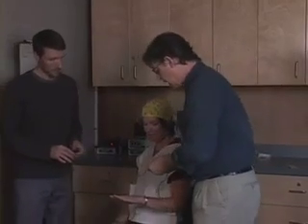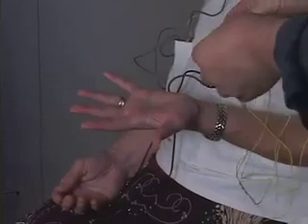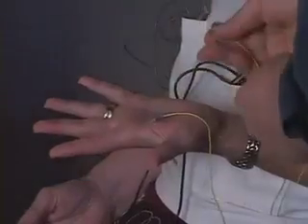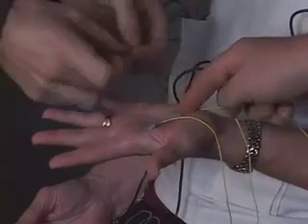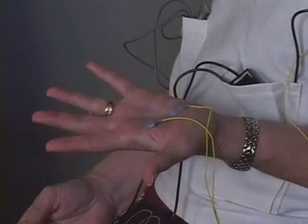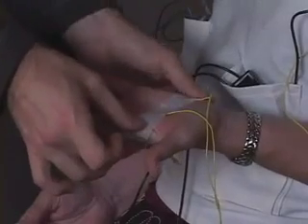Now, Kate, if I could ask you to turn your hand outward, please. We will now demonstrate placing the galvanic skin response electrodes. Okay, place one electrode on the palm, place a little cover over it, and then the next one. There should be at least an inch of separation between the two electrodes. And then secure them with tape. Very good.